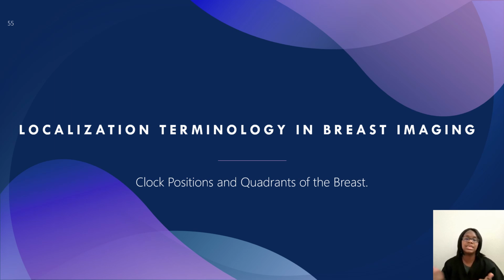So all of this is going to just build up to how we scan, how we get the correct picture to see those cysts, to see those fibro abnormalities. So you have to kind of see this first before you can see, oh, how did they find this cyst, or what made them get this position.